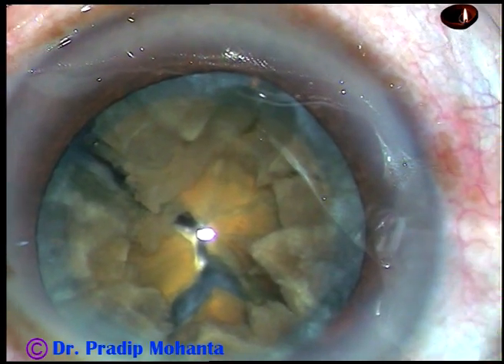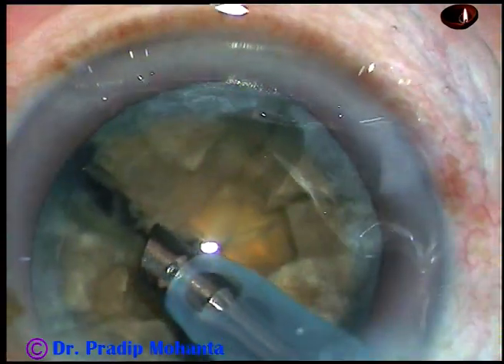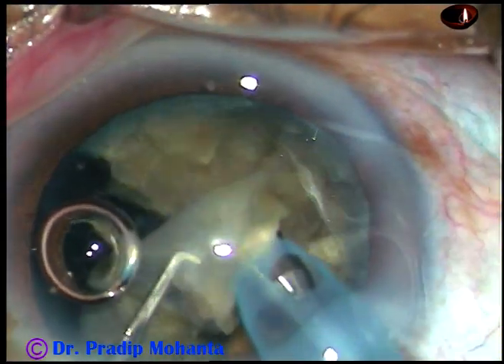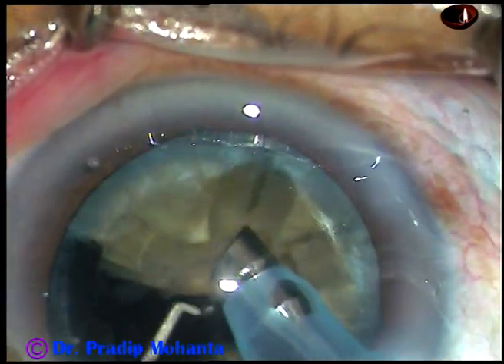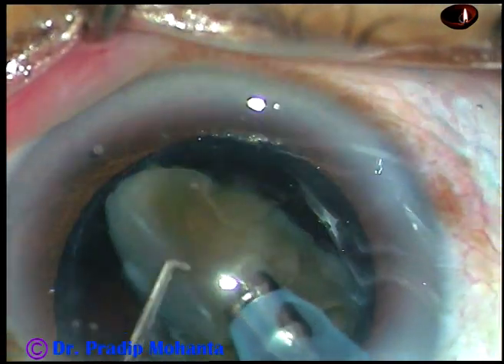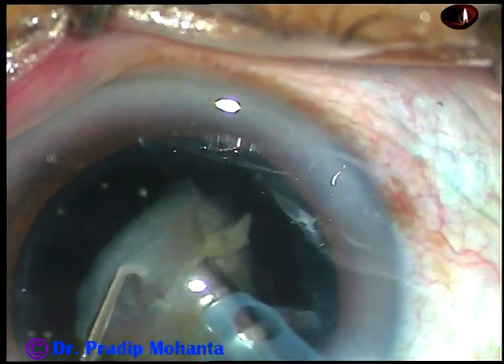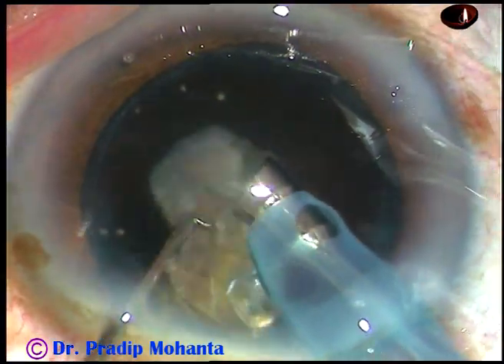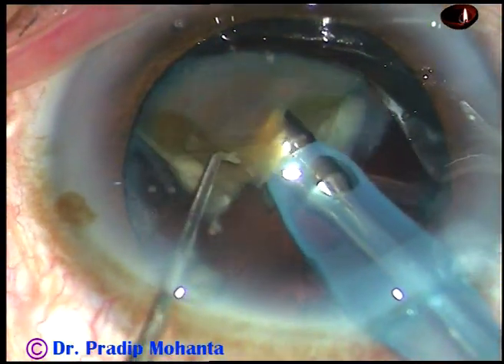And now each fragment is emulsified by ultrasonic energy, which is 75% in this case. Flow rate is 45 ml per minute and vacuum is 450 mmHg. See how quickly you can emulsify each fragment. The power is being delivered in continuous mode and I deliver the power only when the tip is occluded by the nuclear piece.